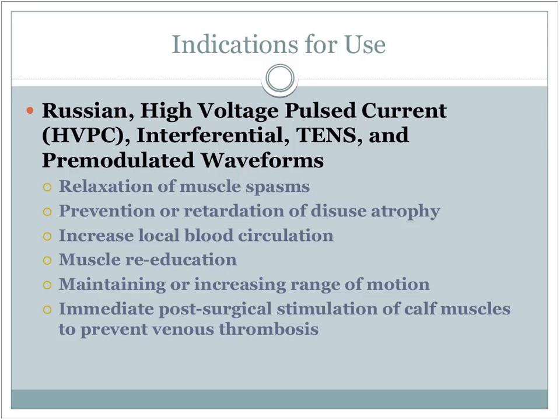You should also have a general idea of what kind of intensity you need to turn this up to under normal conditions to create a muscle contraction. Now, again, don't get hung up on the number. It really does vary, but if you can create a muscle contraction, say, in the extensor mass of the forearm on yourself by turning the unit up to 12, and then you apply it to a patient, with the electrodes relatively the same distance apart, and you're turning it up to 45, I would stop and say, okay, why do I need to turn that up so high?